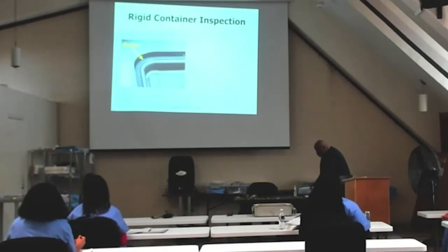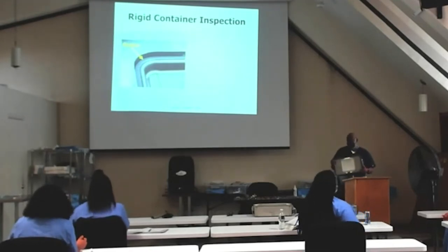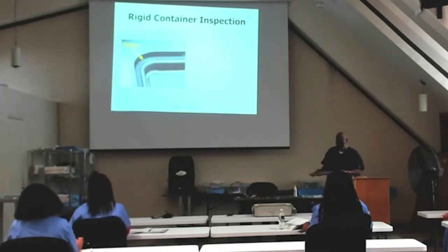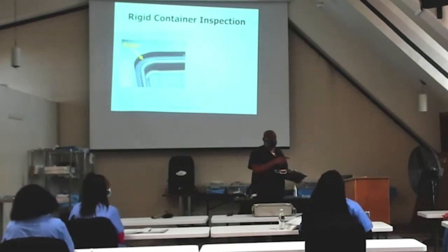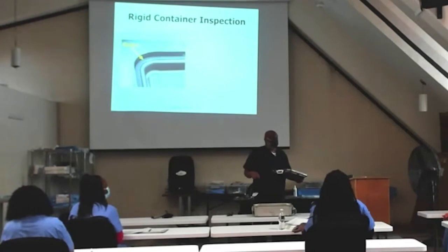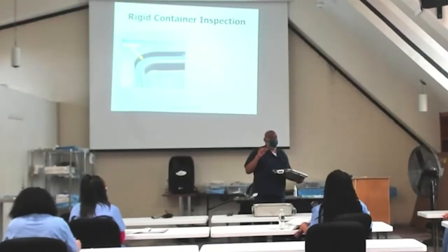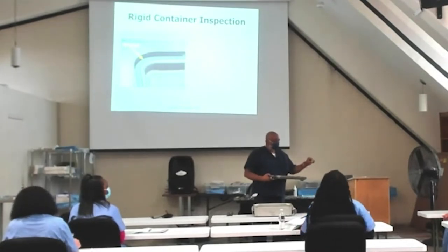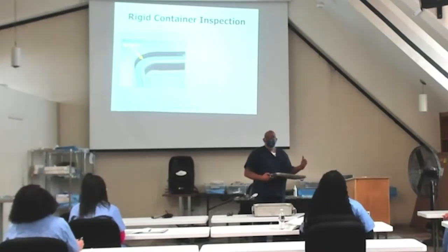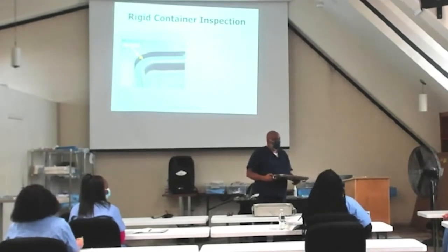You're going to see them here on your lids, and you want to make sure that they're intact. And then you guys, over in sterilization, you've got gaskets going around your sterilizers. You want to make sure that they don't have holes, that they're intact, because Shalea, you keep constantly pushing the door to close, you're pressing the button, and it's rejecting it. So one of the first things you would look at is, let me make sure the gaskets are good, okay?